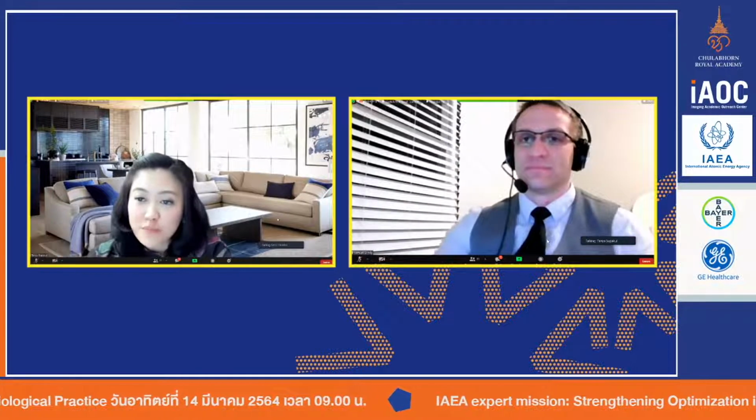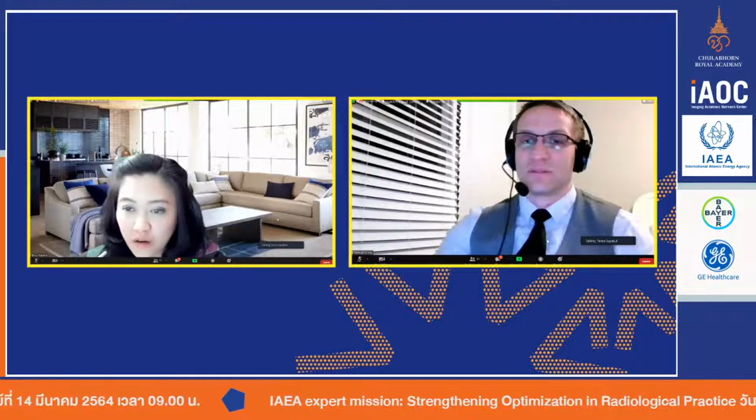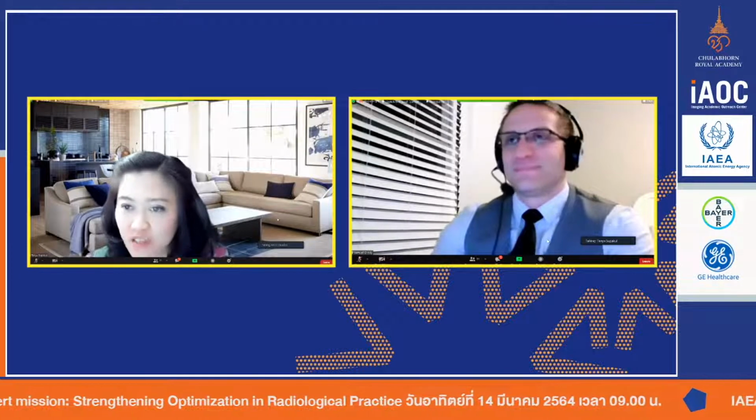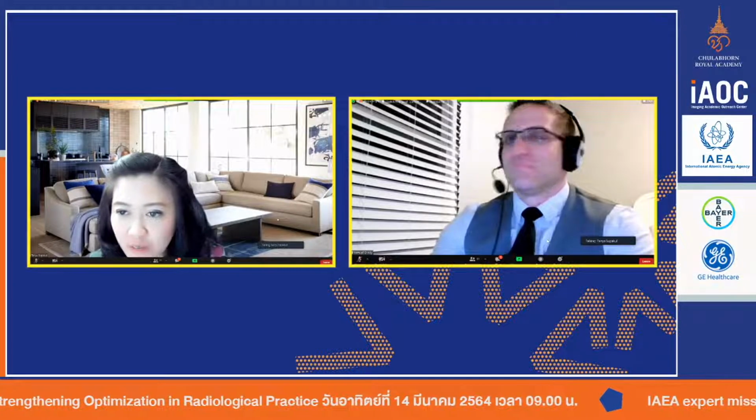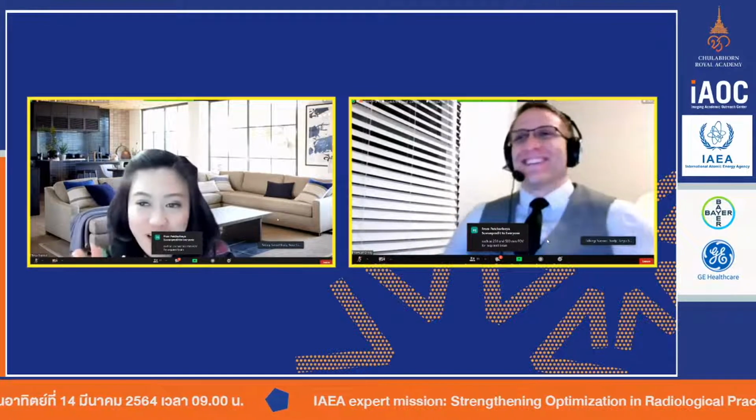Great. So which means these three acquisitions take only maybe 1 or 2 seconds at the maximum to get images, so not much difference in terms of scan time. I was going to say, it'll make a big difference next week when we talk about the body. Yes, but for the brain, probably not.